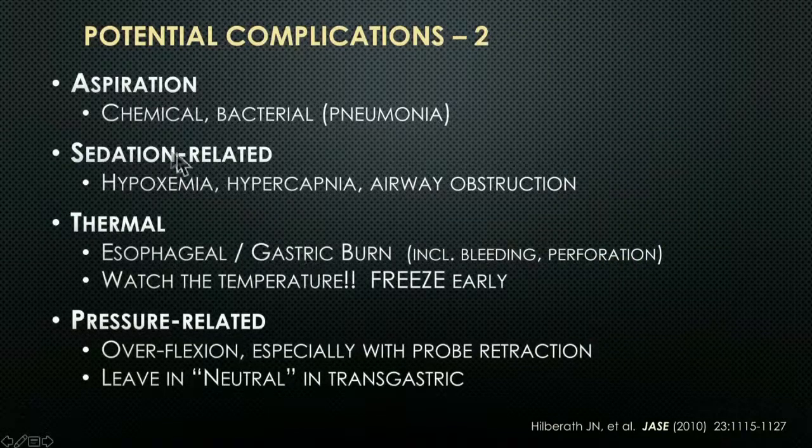You need to be aware that aspiration, both simply a chemical aspiration that may cause transient desaturations, or an aspiration that introduces bacteria and results in an aspiration pneumonia, are also potential complications. These may be sedation related. Simply, you don't have to become hypoxemic from an aspiration. Just simply over-sedation and under-ventilation can lead to hypoxemia, hypercapnia, and airway obstruction.